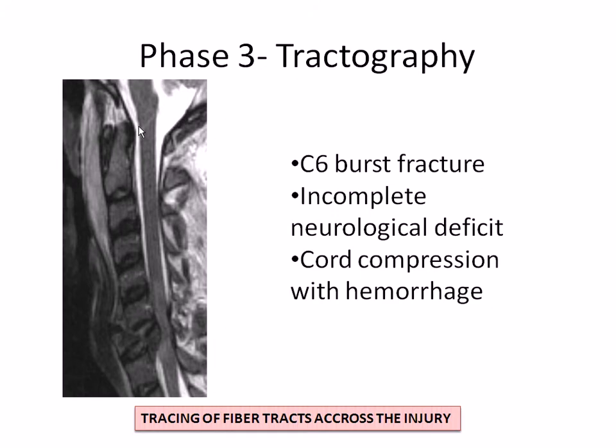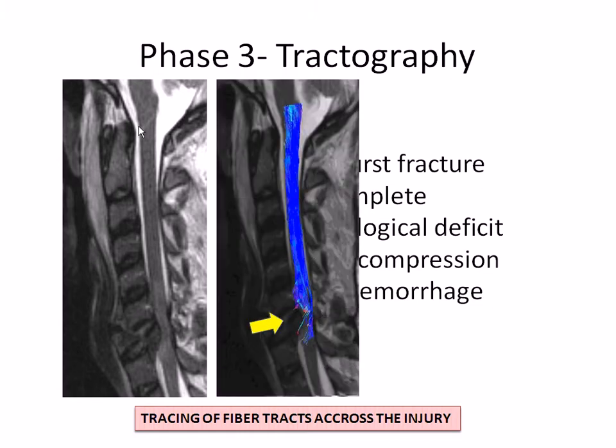Now what does it do in actual life? You can see that we had a C6 burst fracture with incomplete neurological deficit, but you can find that there is a block over there.